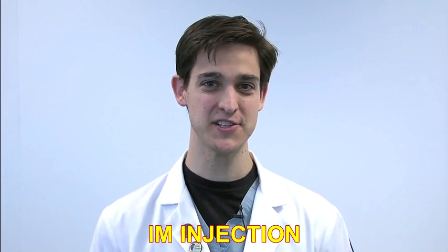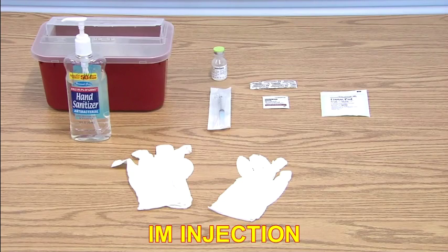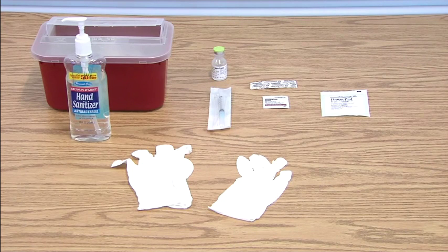Hello and welcome to today's presentation on the proper technique for an IM injection. As far as any procedure is concerned, it's always important to make sure you have your supplies first.